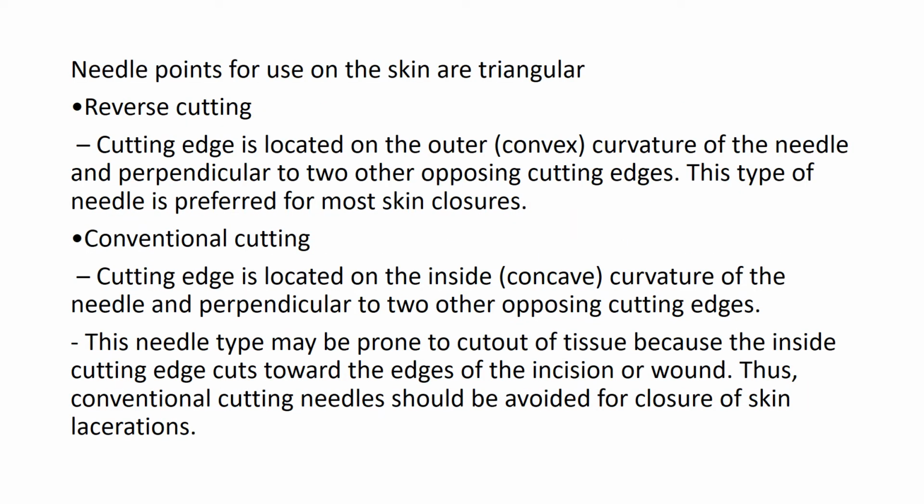Needle points for use on the skin are triangular. We have reverse cutting. This is where the cutting edge is located on the outer or convex curvature of the needle and perpendicular to 2 other opposing cutting edges. This type of needle is preferred for most of skin closure.